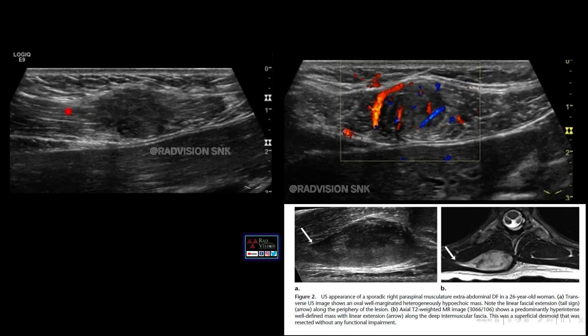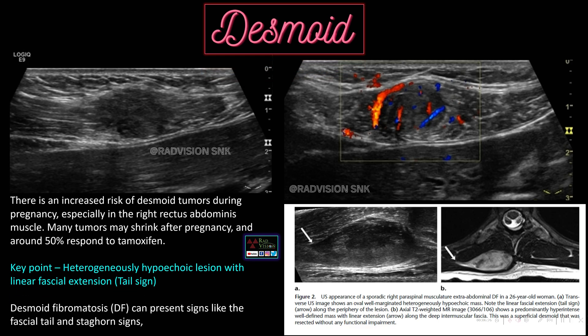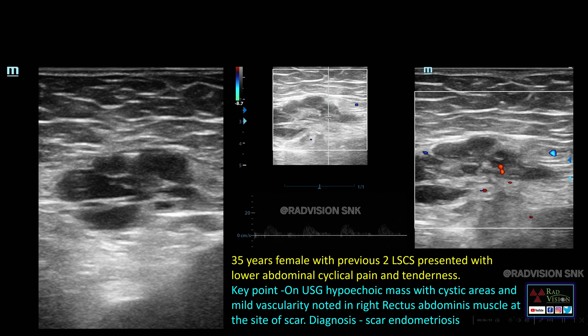Here there is a hypoechoic lesion in the anterior abdominal wall with a linear hypoechoic tail-like extension and raised vascularity on color Doppler. Another case shows a hypoechoic lesion with a linear fascial tail-like extension, classically depicted on MRI as a hyperintense lesion. Whenever you see a hypoechoic lesion with raised vascularity on color Doppler and linear tail-like extension, one of the common differentials is desmoid fibromatosis. There is increased risk of desmoid tumors during pregnancy; many may shrink after pregnancy and 50% may respond to tamoxifen.